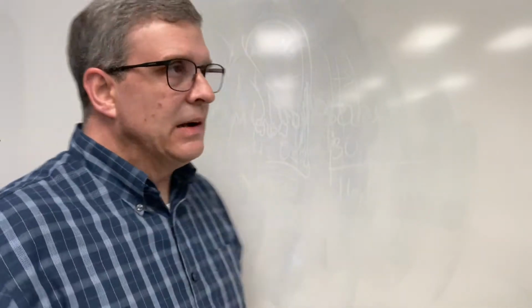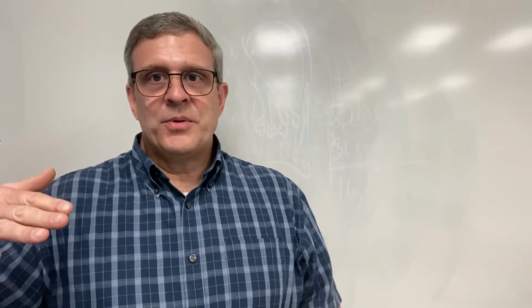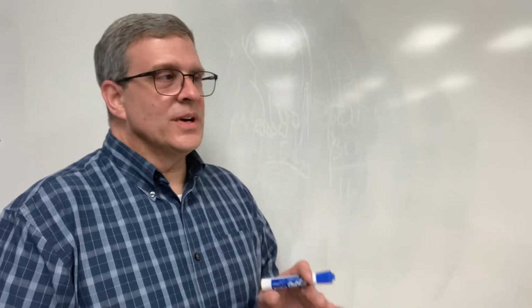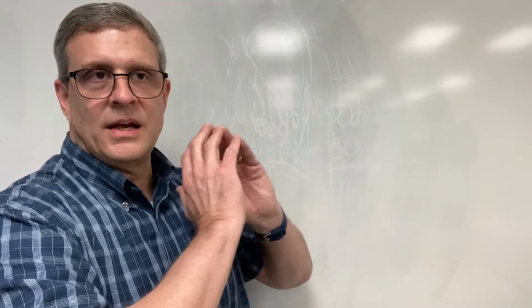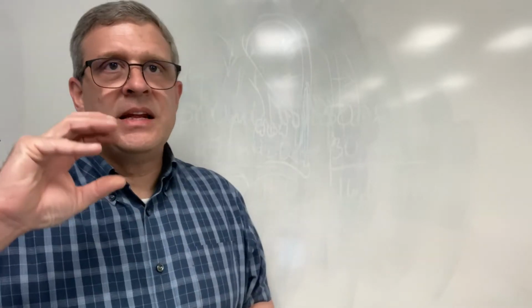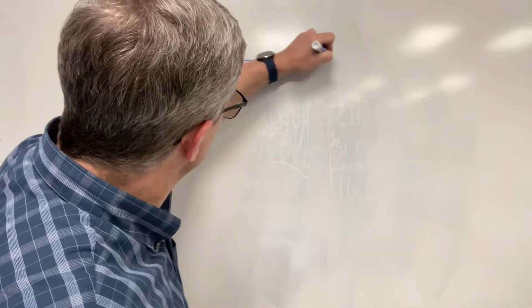Okay, now let's talk a little bit about airway resistance. I like to use the term airway resistance. It's resistance to airflow. And to not use the word resistance in our definition, we're going to say that if air is trying to flow through something, a tube of some sort, it is anything that's going to impede or obstruct that airflow. And so we look at it in its simplest form.